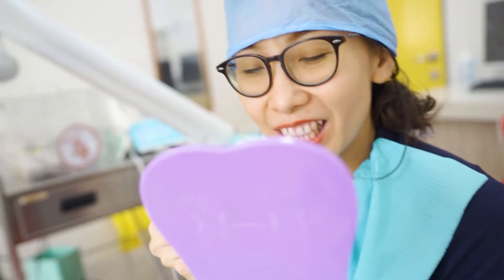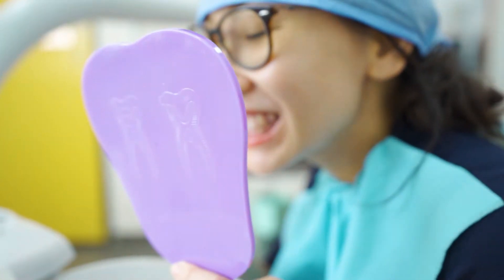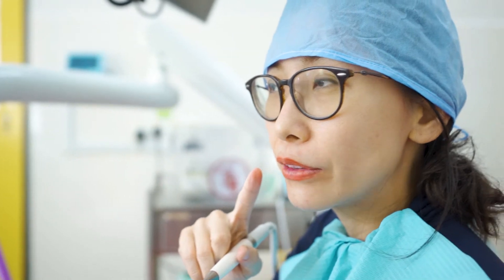This is how I do it on myself, for the first time using airflow. For the plaque disclosing agent, if you can see pink, it means that the plaque formed within one day — we call it early plaque, young plaque, or immature plaque. For the purplish stain, it means that the plaque has formed for more than a day. It is known as matured plaque.